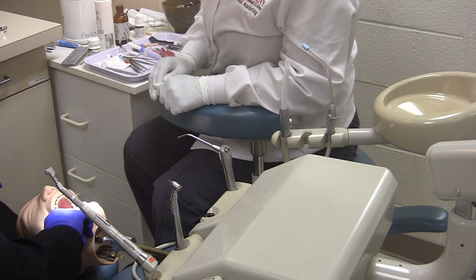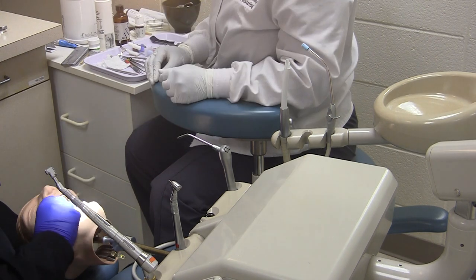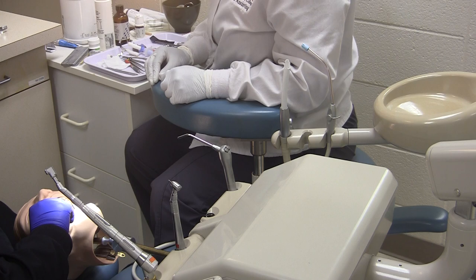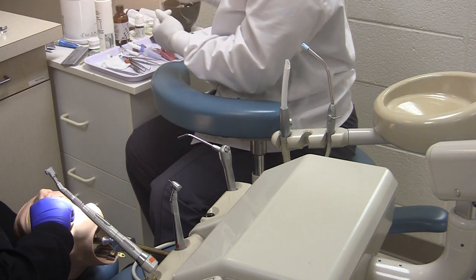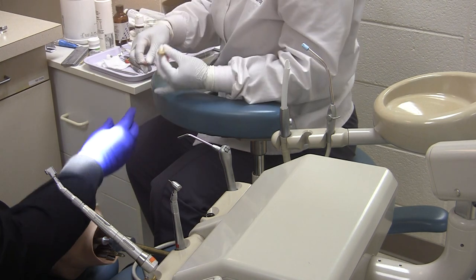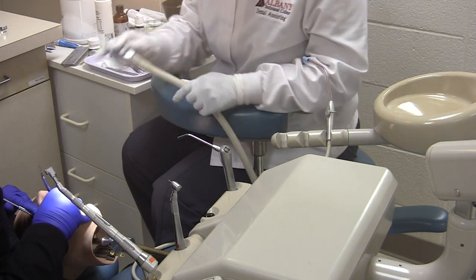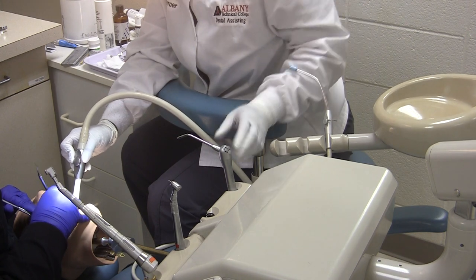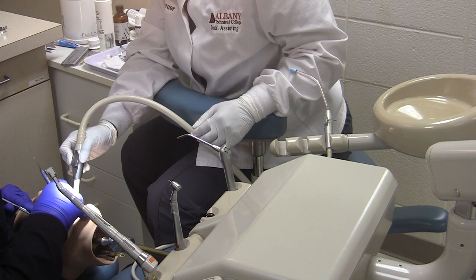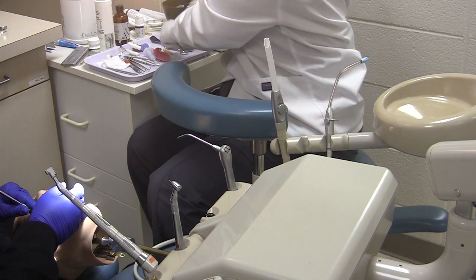After the crown is seated, the assistant will pass the bite stick. The patient would be instructed to bite down firmly until the cement has set. Once the cement has set, pass the scaler, and the assistant, if assisting the dentist, would use the HVE to suction. After scaling, the assistant would then pass the knotted floss.